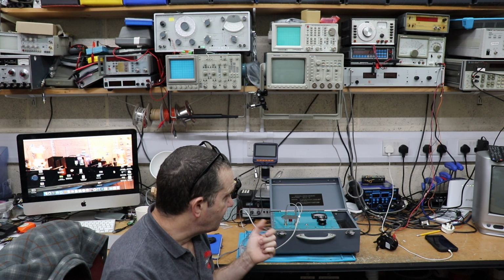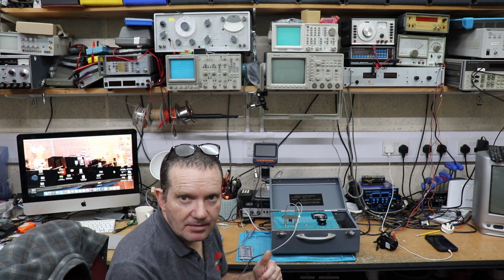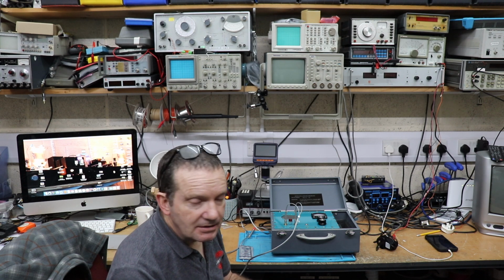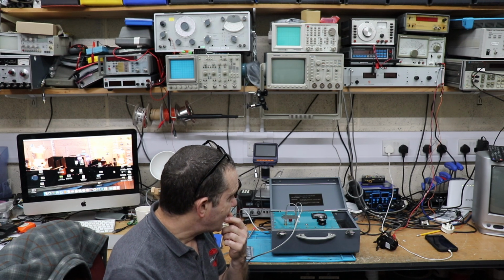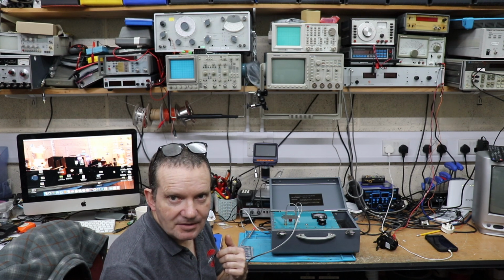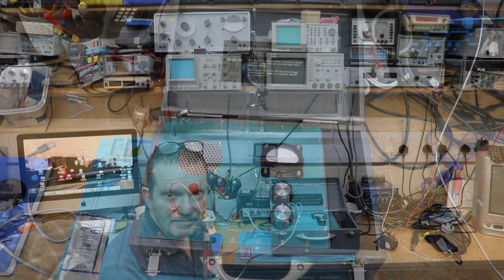Anyhow, what we're going to do is have a closer look at this machine, and then we'll have a quick look at what it looks like inside. I'll show you the circuit diagram, just to show how simple these machines are to build. And I hope you enjoy it. It's something a bit different from engines and amateur radio, but it's a nice piece of equipment to use in the day job. Anyway, let's crack on.